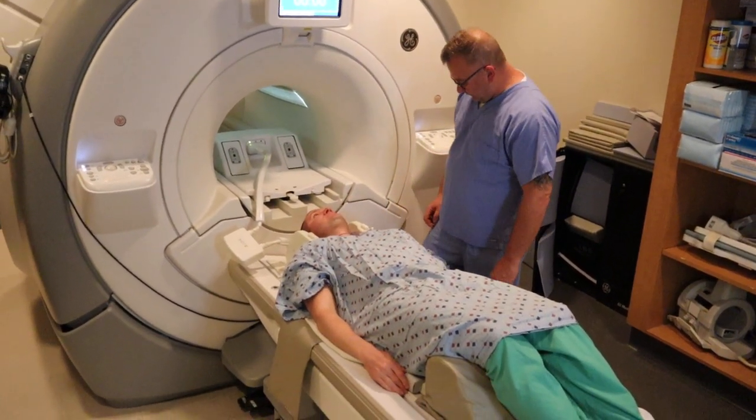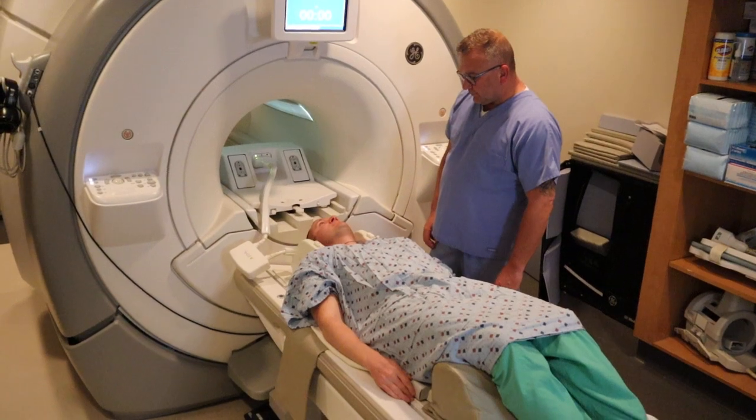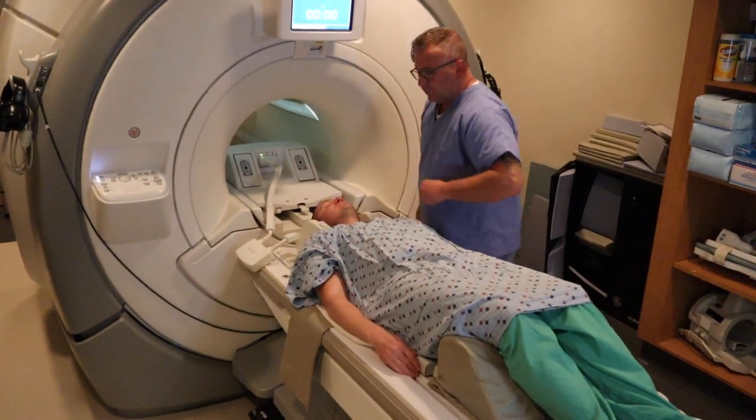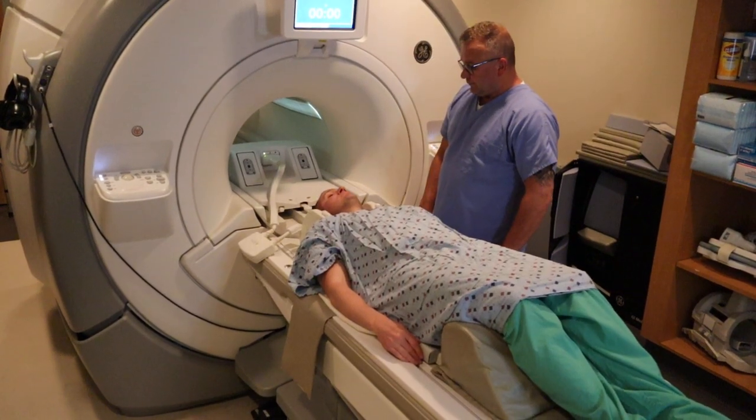This patient is going to be positioned for a cervical spine and a soft tissue neck. The patient is going to be laying recumbent head first on the CTL coil.